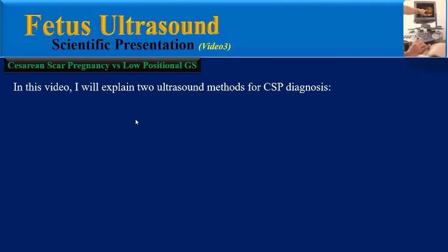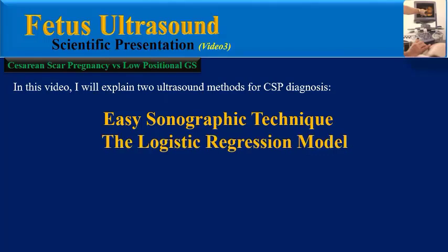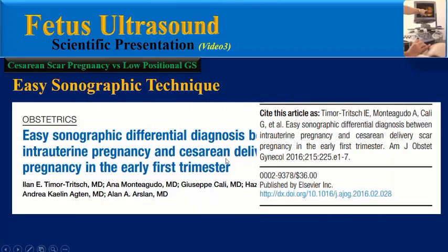In this video, I will explain two ultrasound methods for CSP diagnosis. The first one is an easy sonographic technique, and the other is the logistic regression model. The sonographic technique is according to a paper which was published in 2016.